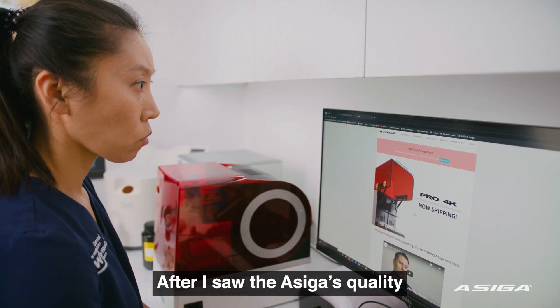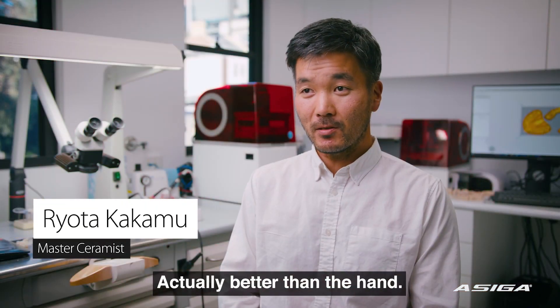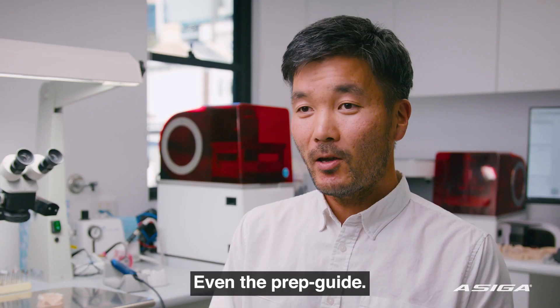After I saw the Asiga's quality, I realized — oh, that's the best thing, actually better than by hand. I printed everything in the Asiga Max UV: temporary crowns, even the prep guide.